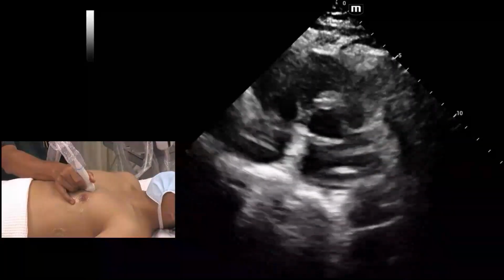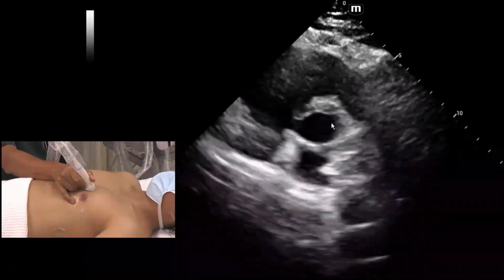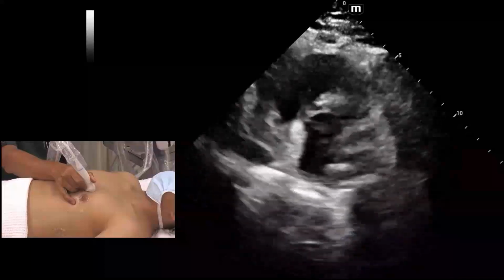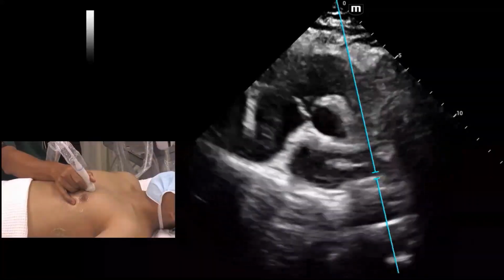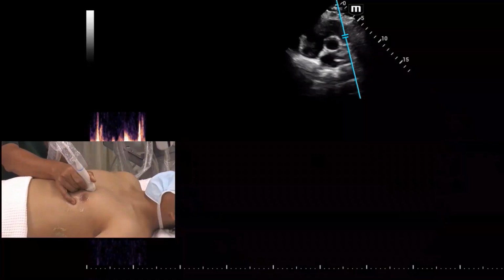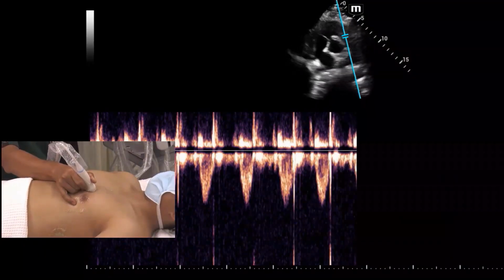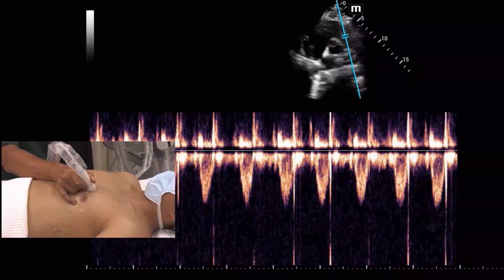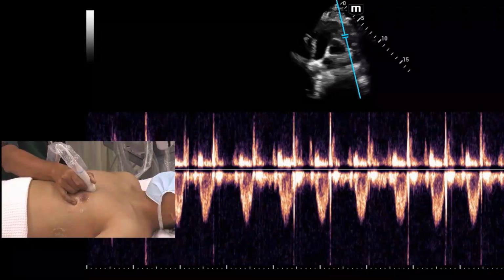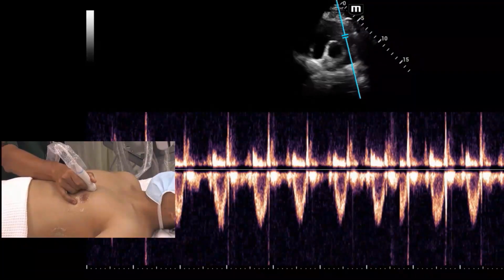You know there's a fold there, the aortic valve level. Okay, there is RV there. Yeah, this is the pulmonary trunk, right? So what you get is RVOT similar. You get the PW there, put it there, and similar. Okay, but this is not the LVOT VTI. This is RVOT VTI. Can you get the variability in RVOT VTI in intravascular volume restriction? The answer is yes. Some people found this having difficulty.